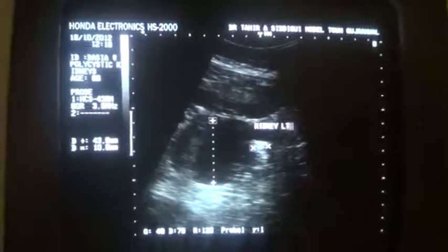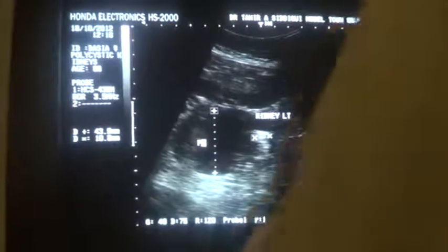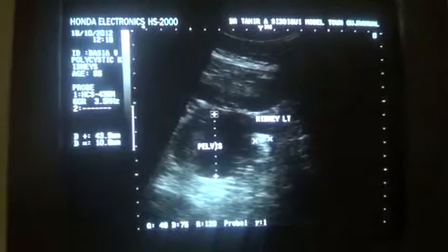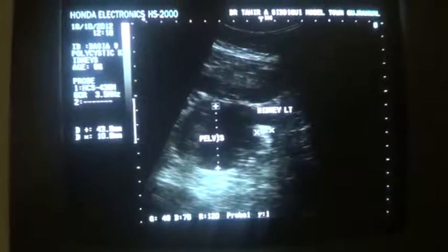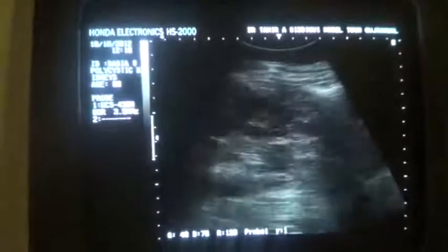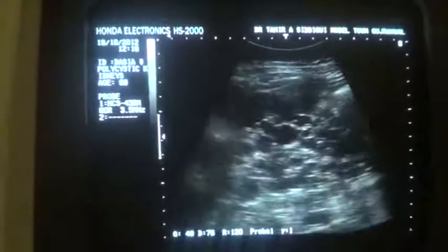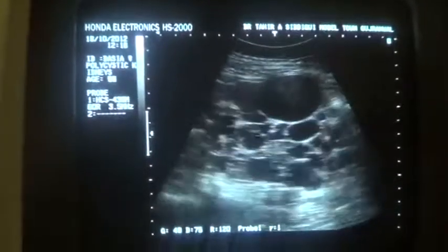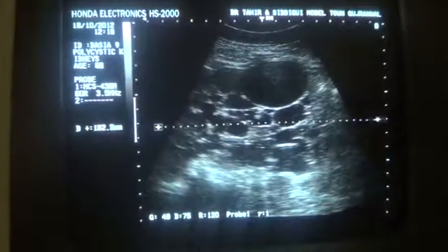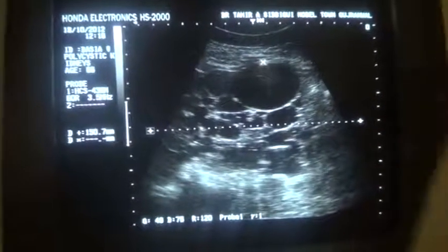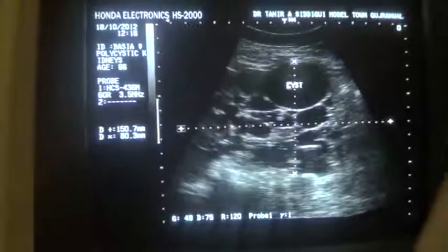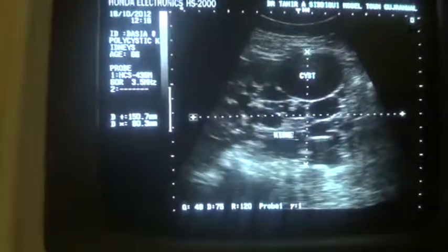This is the left kidney. This is the pelvis. The pelvis is dilated and there is a calculus; however, in this case the proximal ureter is not seen dilated. This is a typical appearance of polycystic kidney — bilateral — and the parenchyma is totally lost. Approximate measurement: 15 cm in length and 8.0 cm in anterior-posterior diameter. All these are cysts, and this is the left kidney in longitudinal section.